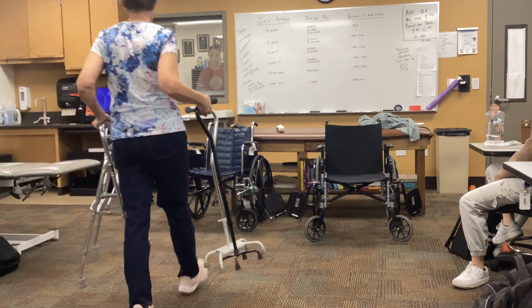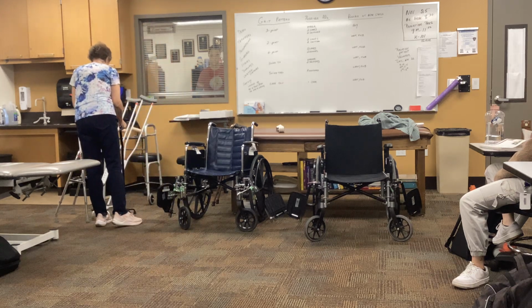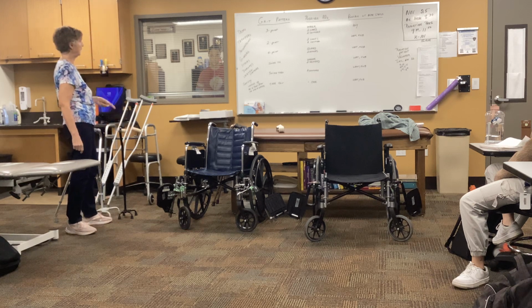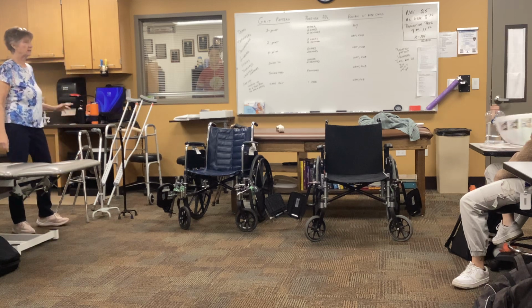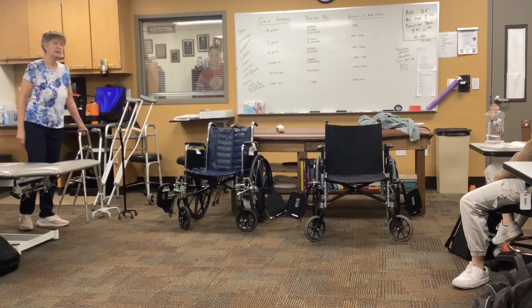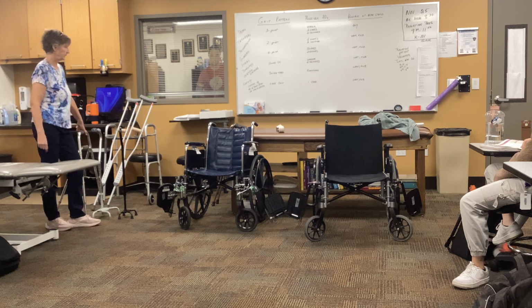Okay. So, I have cane gait listed separately there. And using 1 cane means 1 single-point cane, 1 small base quad cane, 1 large base quad cane, or 1 hemi cane or hemi walker, whichever term you're particularly reading.